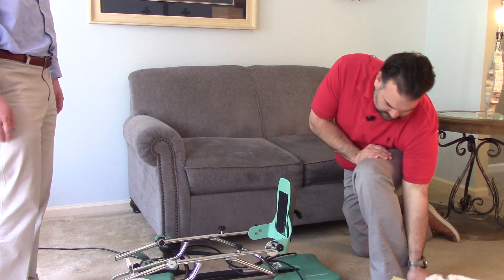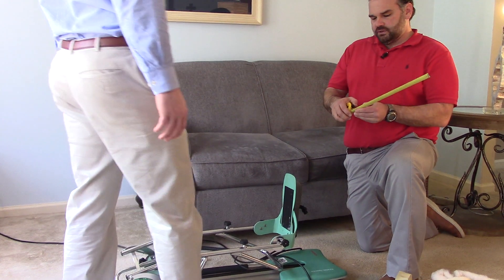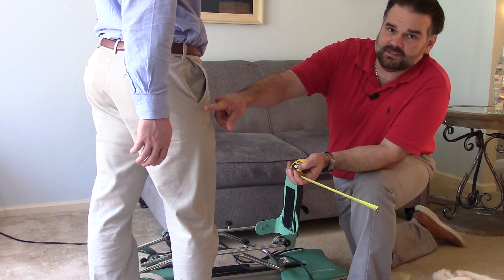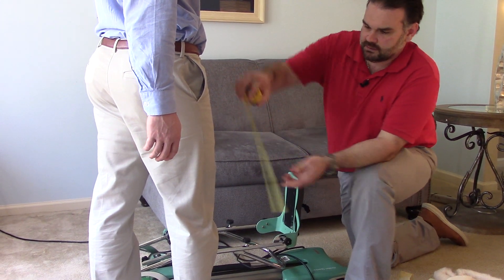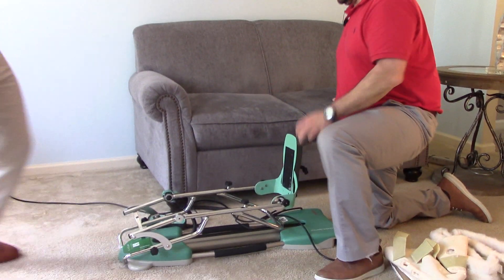So the first thing we're going to do is measure the patient. We've already measured Russ, so we know he's at 15 inches, but you're going to measure from the middle of the knee to the bottom of the hip. So we got Russ measured here, and then we'll set that to the side.